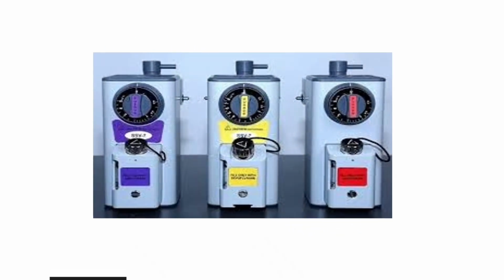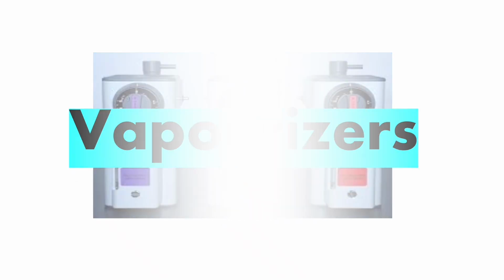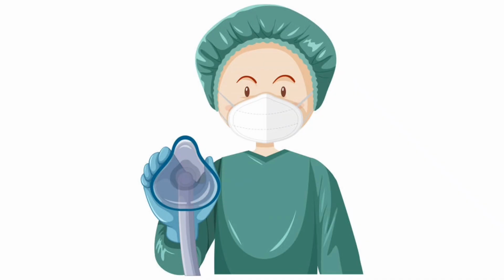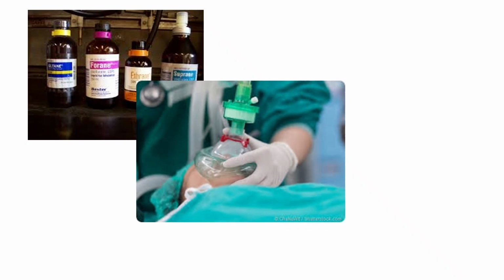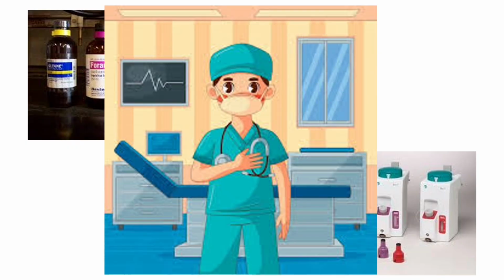We all know anesthesiologists use inhalational anesthetics for induction and maintenance of anesthesia. Every anesthesiologist should understand the basic physical principles and the way they influence the design of the vaporizer, as this will help the anesthesiologist to select the vaporizer well suited for his or her practice and to use them economically, safely, and to maintain them in optimum working condition.